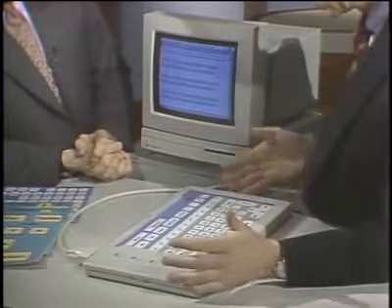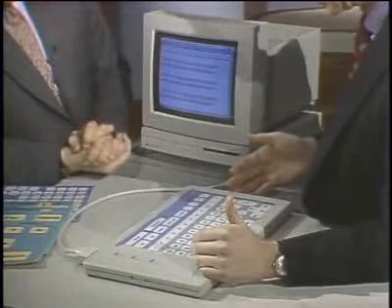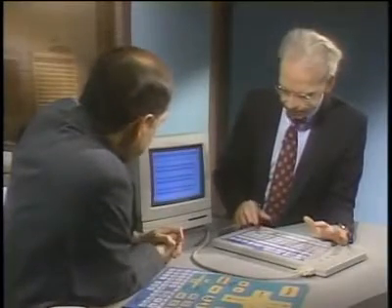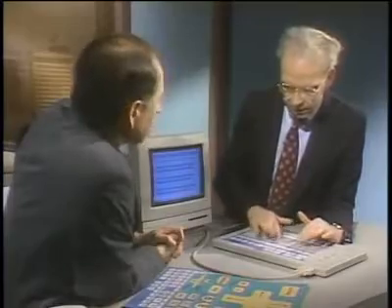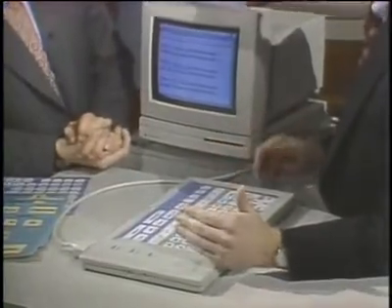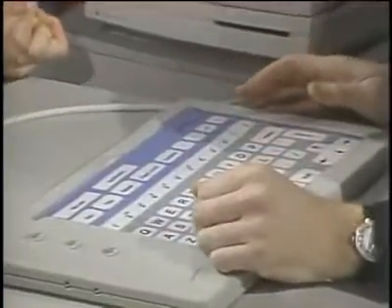Well, the keyboard contains everything that the regular keyboard and mouse would enable a computer user to do. I can move the cursor, for example. I can enter text. And basically, I have larger targets, so a person with a head pointer or a mouth stick or a hand stick can use this keyboard much easier than they can use a standard one.